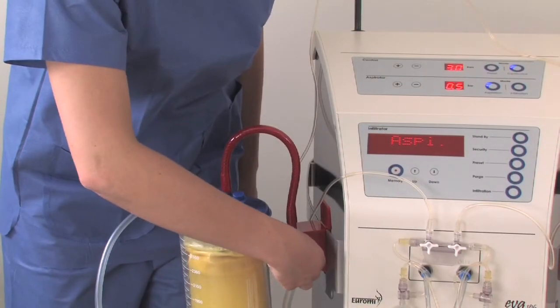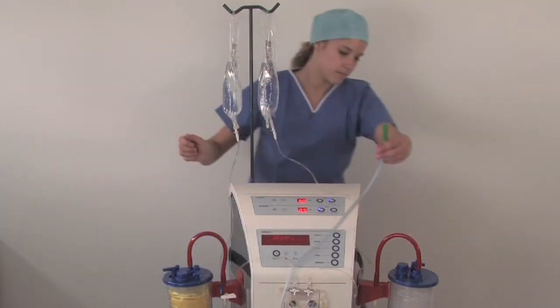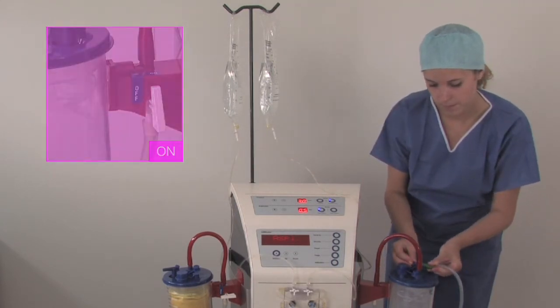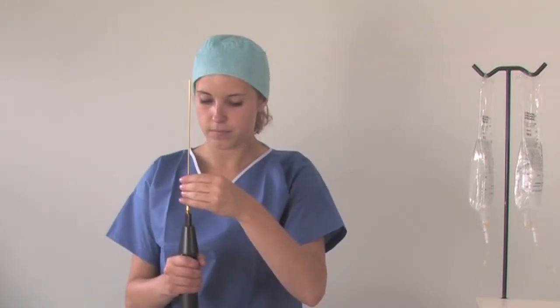When the first canister is filled, connect the fat tubing to the second canister by closing the first switch and opening the second one. When the procedure is over, unscrew the cannula.